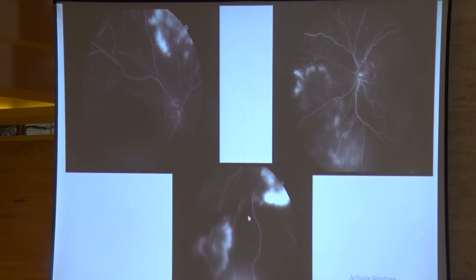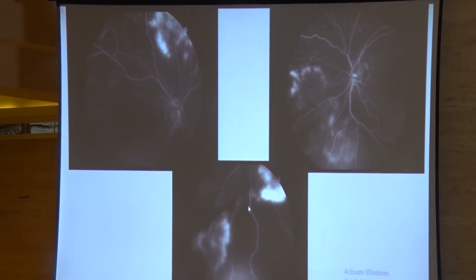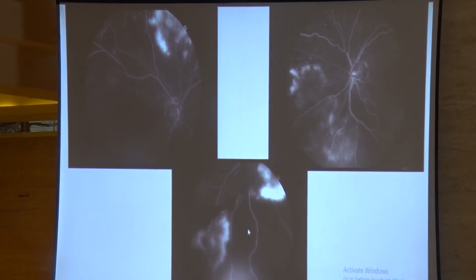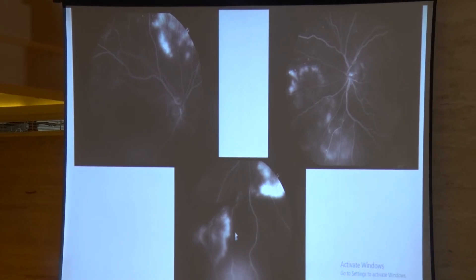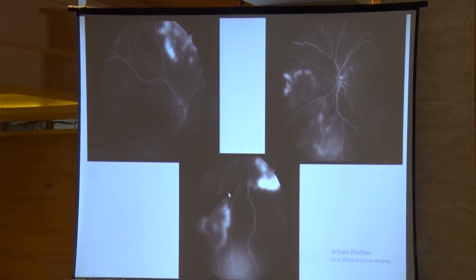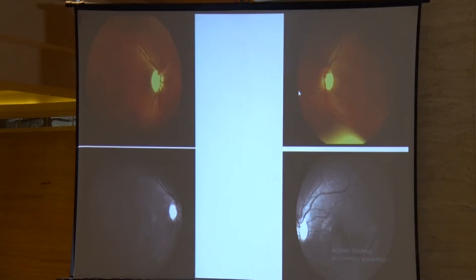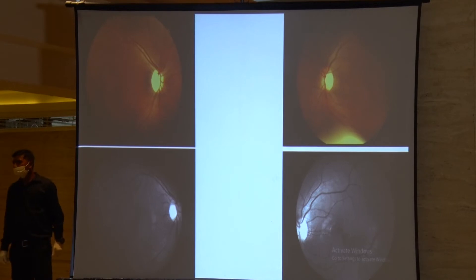You can see transmission defect — blocked fluorescence due to hemorrhage — and these are the NVs (neovascularizations). You can very easily see that they are occurring at the junction of perfused and non-perfused retina, and you can beautifully see the floret NVs. This is a case where red-free photographs and fundus photographs can suggest a circular lesion, probably a CSR.